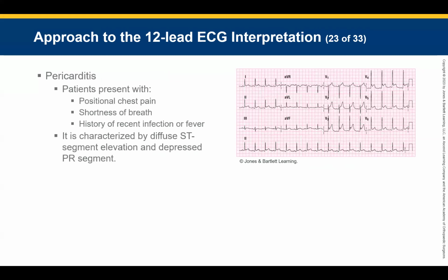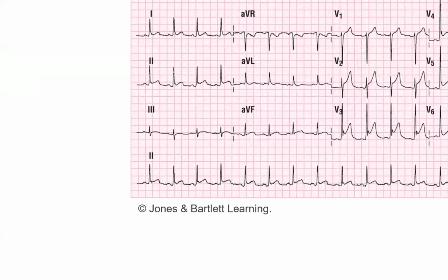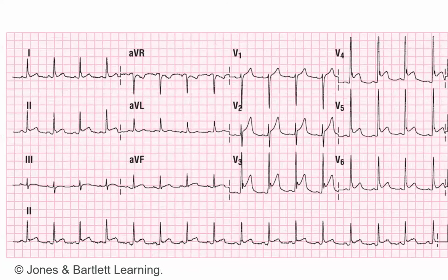There's benign early repol. Let's give it a slide. I guess this one's changed. It's different. All right, cool, we'll pull this one up. He didn't have the fancy change slides on there, so it's hard for me to tell. All right, base rhythm. We have P waves. PR is normal. R-R is regular. So we're in some sort of sinus rhythm. 300, 150, 100, 80, 90, somewhere. 90? So normal sinus rhythm.